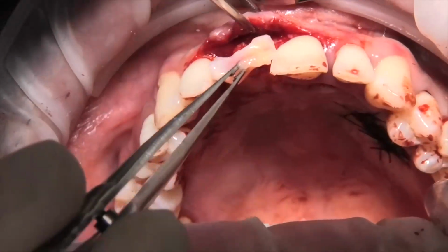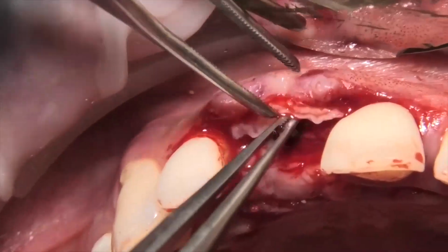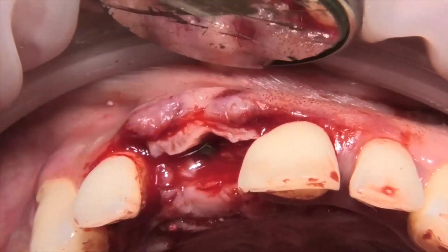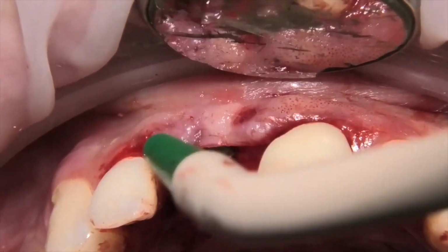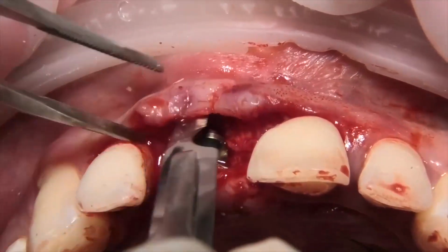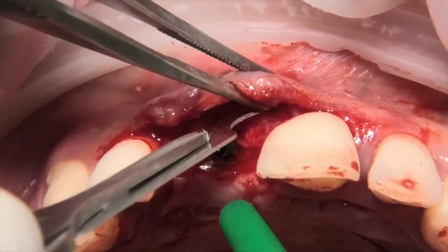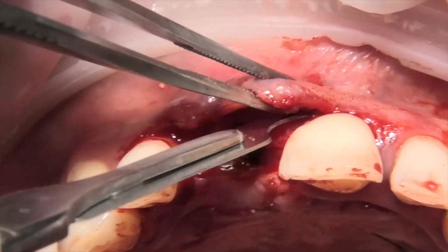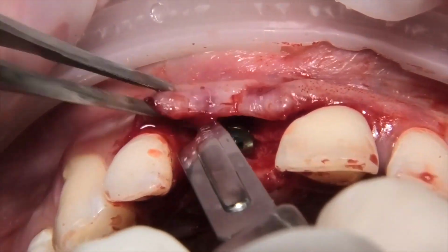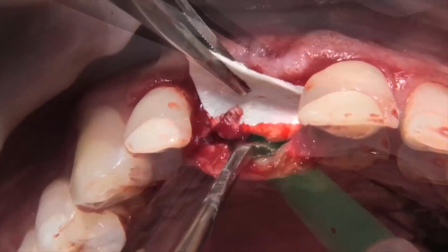First of all, we can check the connective tissue graft that we had taken from the palate area. Now after this we can make the incision with the scalpel and new 15C blade in the bottom of the flap in mesiodistal direction, separating the periosteum from the overlying flap until it's completely relaxed. We have to pay attention not to cut the flap.